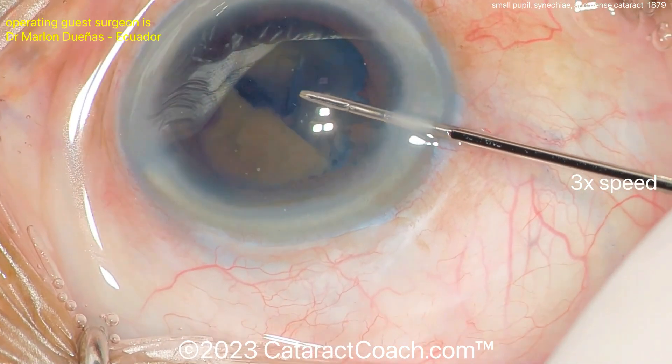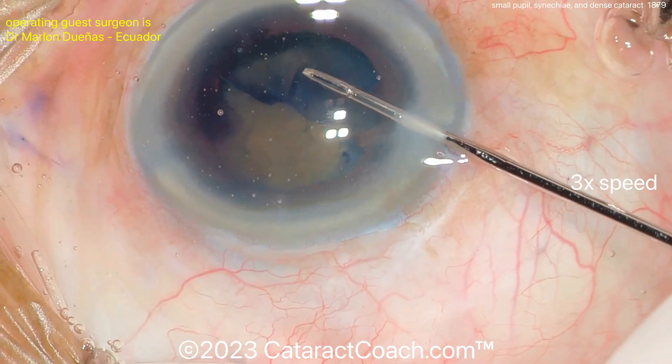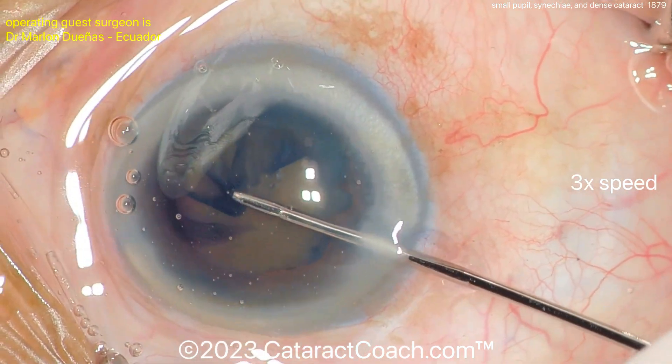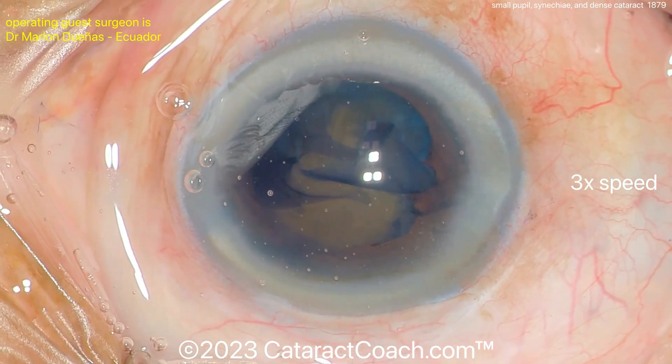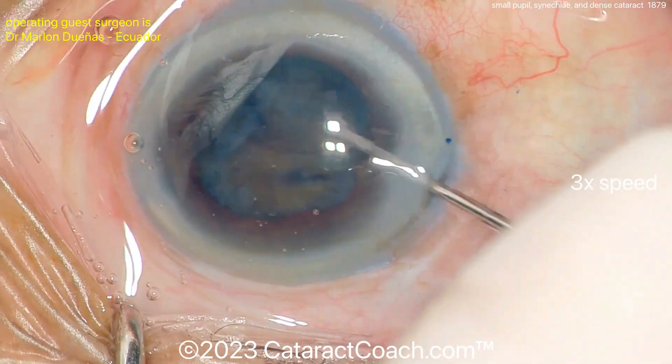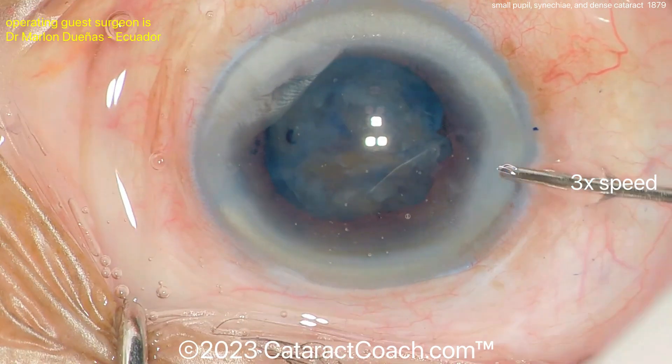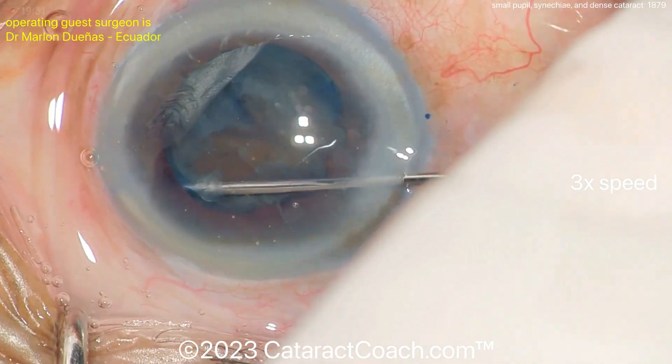Putting that viscoelastic in is a temporary measure but it expands the pupil nicely. Now getting the rhexis done — don't make a baby rhexis; get a good-sized 5 mm rhexis. Beautifully done here using micro forceps through a side-port paracentesis incision. Once the rhexis is complete, remove the instruments and move to some hydrodissection to rotate the lens.